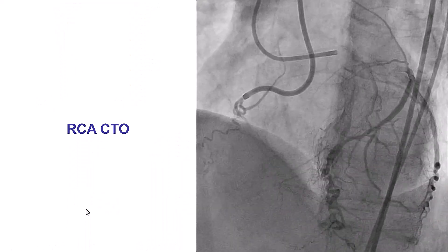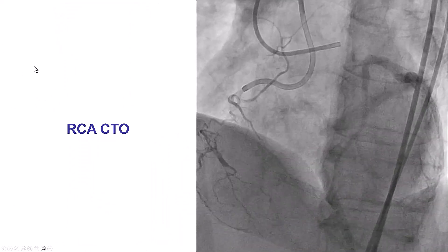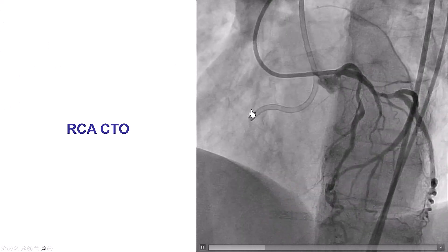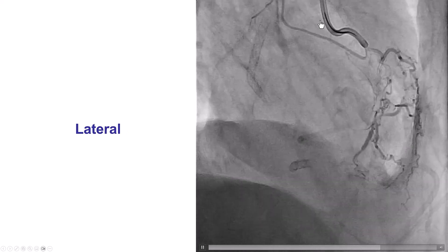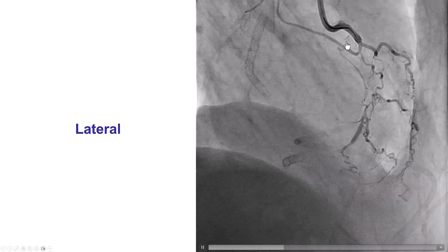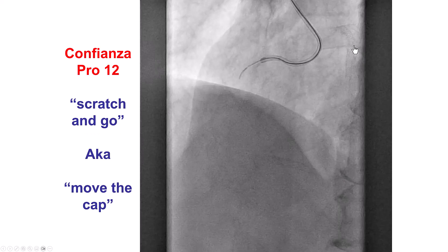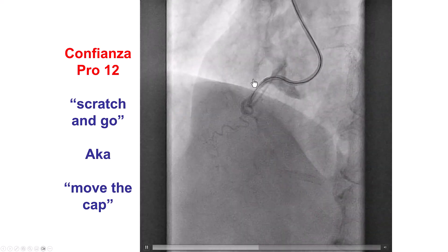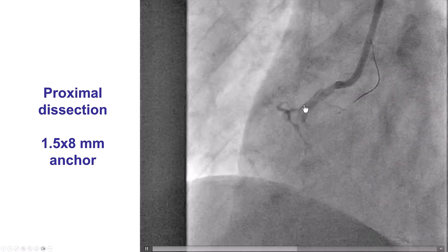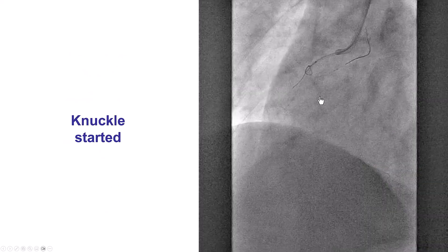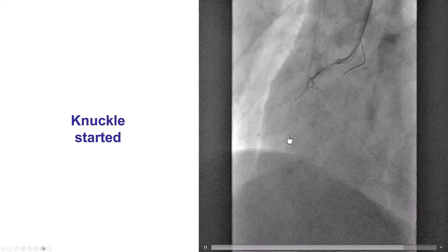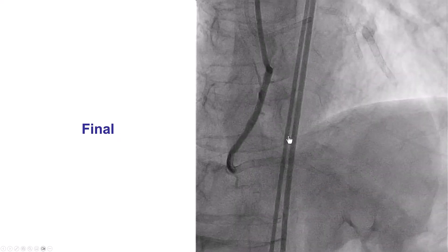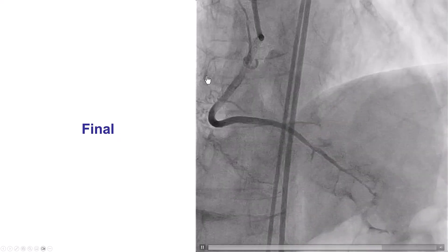This is an example of the scratch and go technique applied to a right coronary artery CTO with multiple branches originating at the proximal cap, making it difficult to understand where the lesion starts. Multiple projections did not help, as there were still a lot of branches and it was hard to know where the CTO starts. So in this case, we used the Confianza Pro 12 wire, injured the proximal vessel, and caused a dissection. Once we had a dissection, we were able to advance the knuckle through the dissection area, going along the course of the right coronary artery, followed by re-entry and successful stenting.